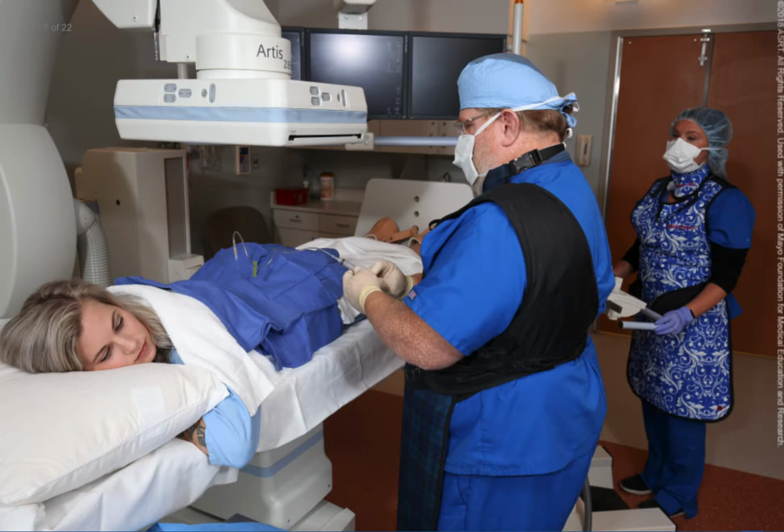The Bucky slot cover is engaged to reduce exposure to the staff and others. The hands of the operator should be kept out of the fluoroscopic FOV as much as possible, or sterile lead gloves should be used to reduce dose. Preliminary scout images of the spine are obtained before the procedure begins.